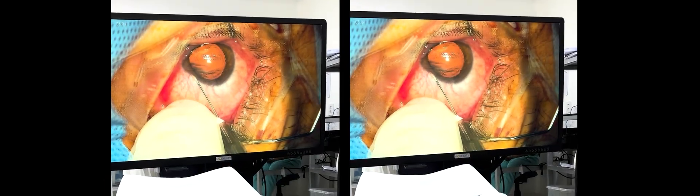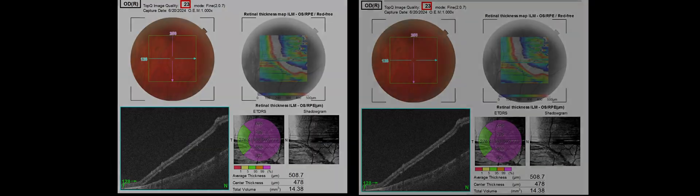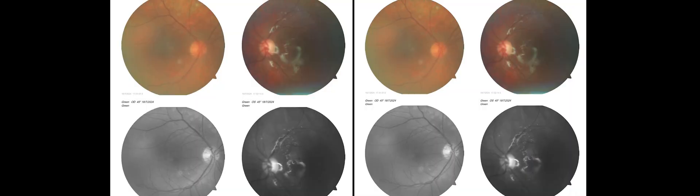Initially the patient underwent pneumatic retinopexy for a superior retinal detachment, and the retina remained attached for several days. OCT and retinal images show pre and post-op laser results. Despite barrier laser, gas injections, and proper head positioning until the gas bubble dissipated, the retina detached again after three attempts, yet the macula always remained spared.